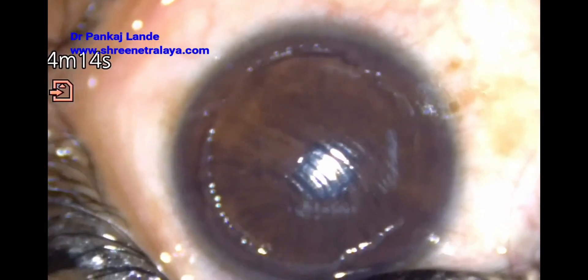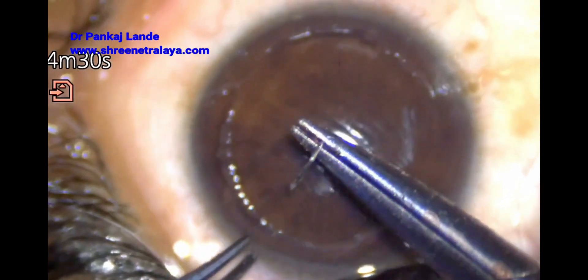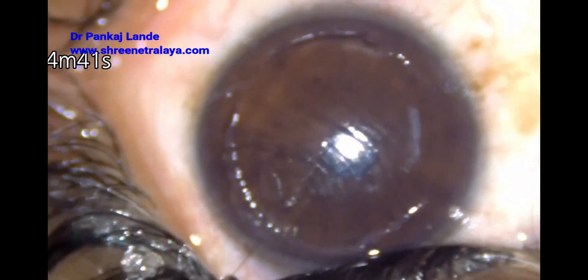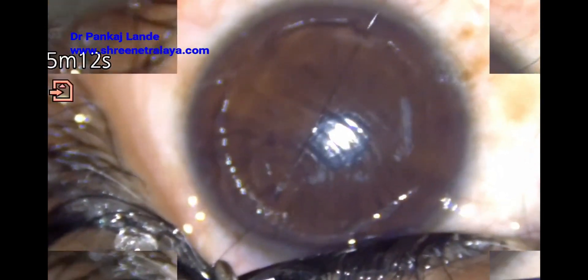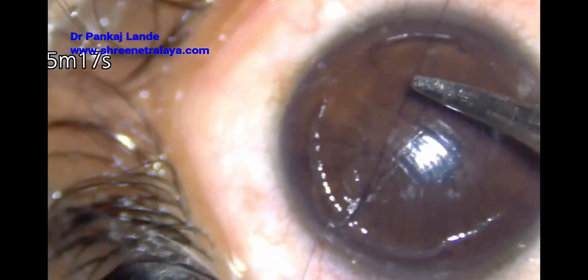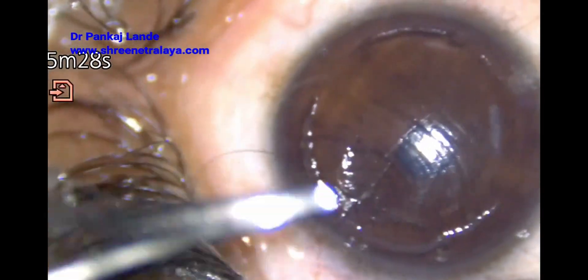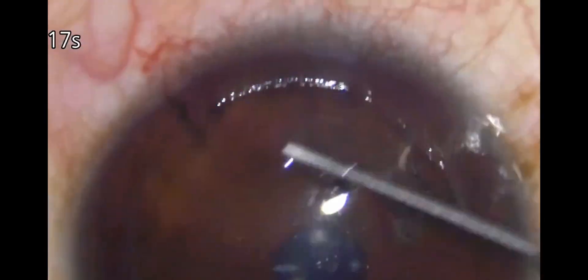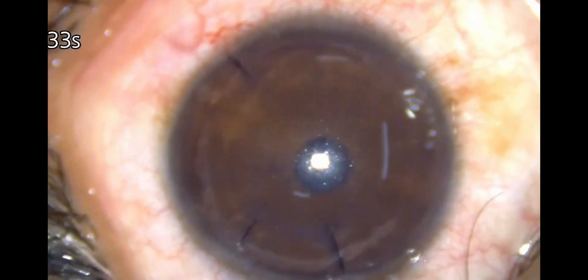But if you leave this flap for a longer duration, you need sutures to be used. If the flap is folded or having striae for more than 48 hours, I use sutures. I select the location of my sutures very carefully to relieve the strain on the flap.